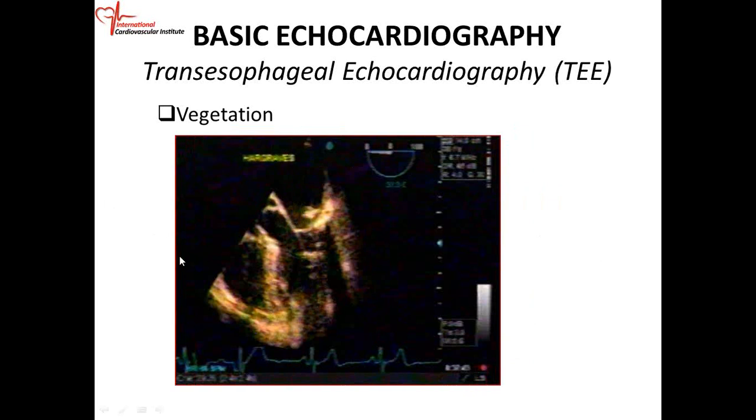We treated her with antibiotics, and she did very well. So this is a vegetation on the posterior mitral leaflet.